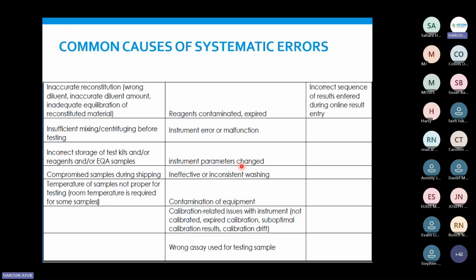That can also happen when you follow the wrong format. So sometimes you find that the report for hematology will give you a certain format according to your printout. But when you did configuration, it gives you a different order. So you need to be very keen on what you are submitting. So if you are submitting calcium, you need to put it under calcium and so on.